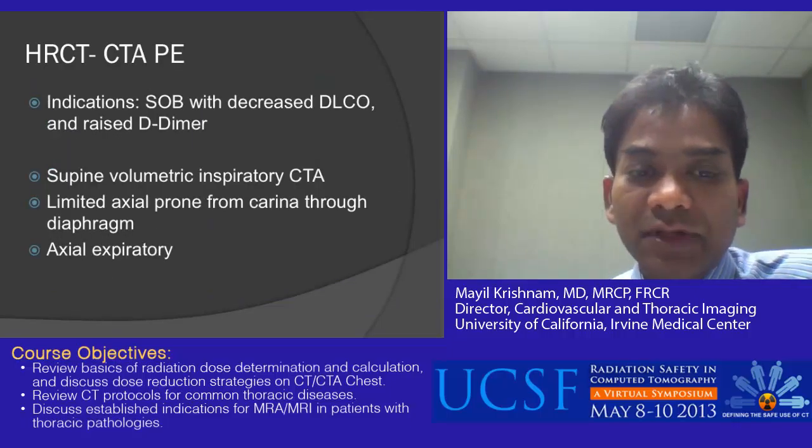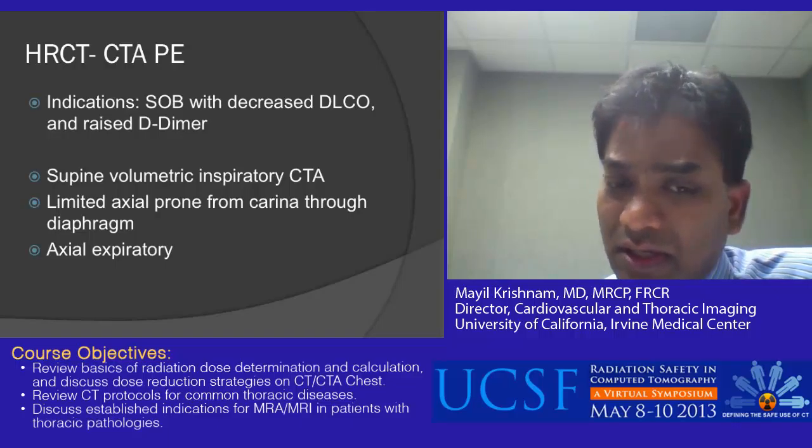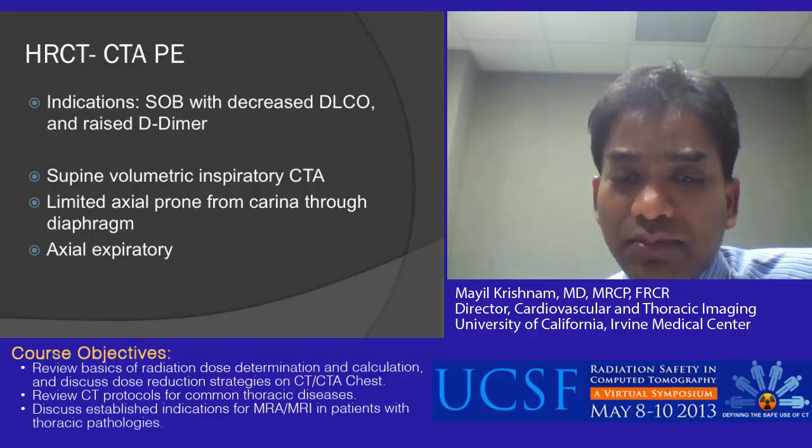Next slide. We do come across sometimes clinicians wanting both high resolution chest CT and a CT angiogram to assess for pulmonary emboli because patients present with some shortness of breath, decreased DLCO and raised D-dimer.